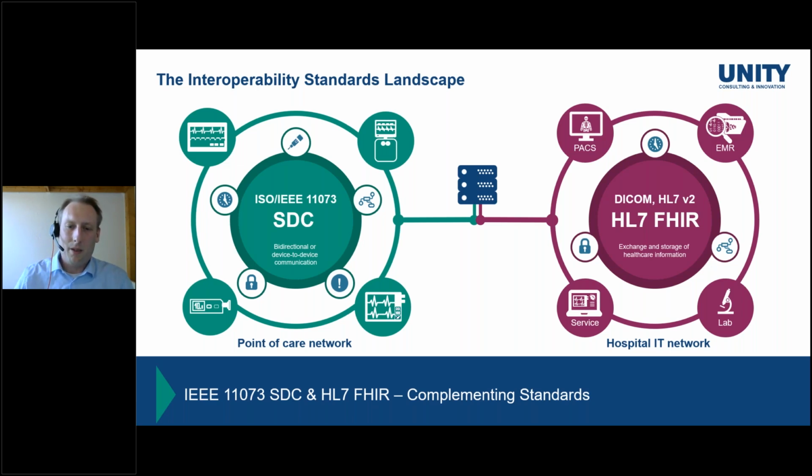So to sum it up, from a device perspective, the standards landscape focuses, for directly patient-related care applications, on IEEE 11073 SDC on the one side, and HL7, hopefully in the future mostly HL7 FHIR, on the other side. And these can be connected via a two-way interoperability bridge that translates from SDC to FHIR.